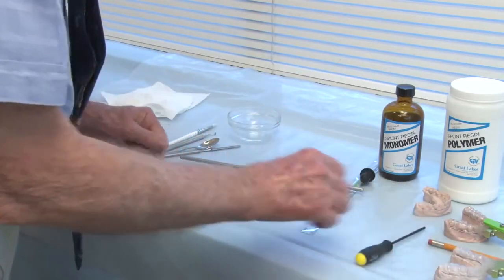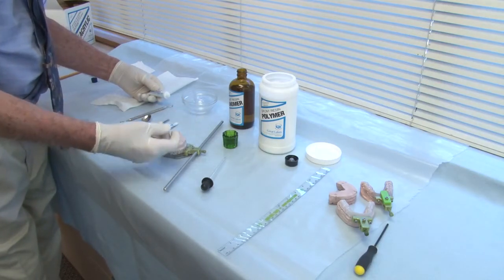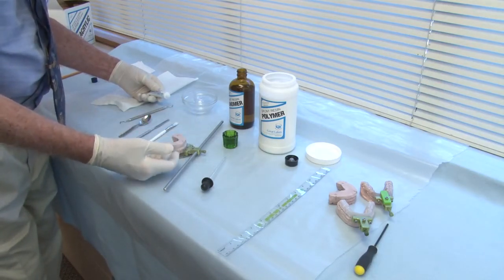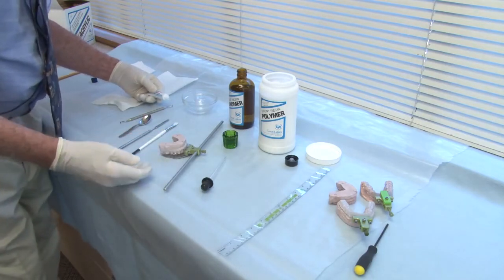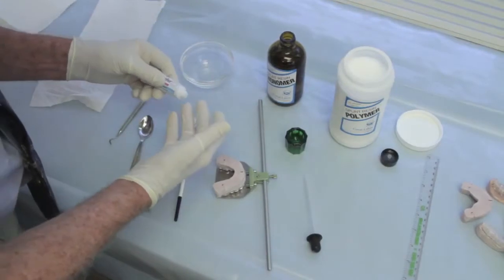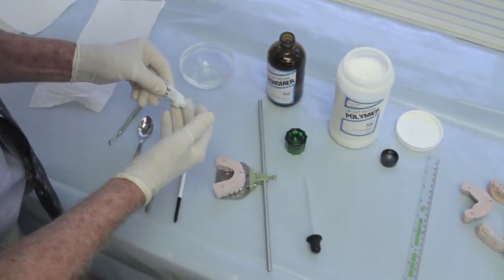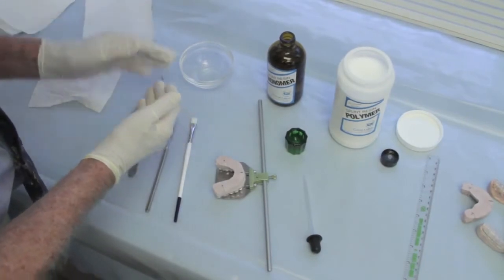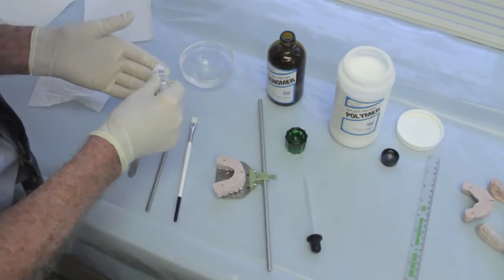So your quick cure acrylic, the screw holds the quick cure acrylic to the Biocryl base and to the clutch frame. When you work with acrylic, always be sure and wear gloves to protect your hands. You will develop a reaction to the acrylic, an allergy to the acrylic. Just get in the habit of wearing gloves all the time. And the other thing, when you're working with your acrylic, if you put a little Aquaphor on your gloves, it helps to keep the acrylic from sticking to the gloves so much.